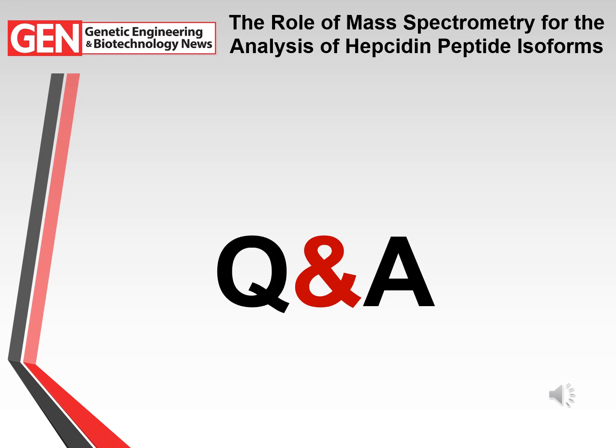Sometimes that's not possible, but we want to make sure the methodology is completely harmonised. The best way to do that is to think about how we set up our samples so that we can do all of the appropriate aliquoting right up front.